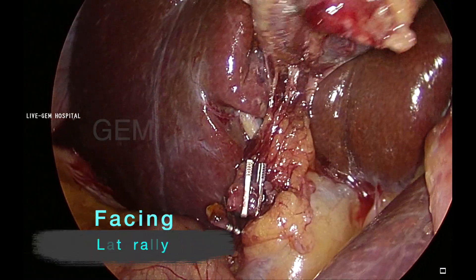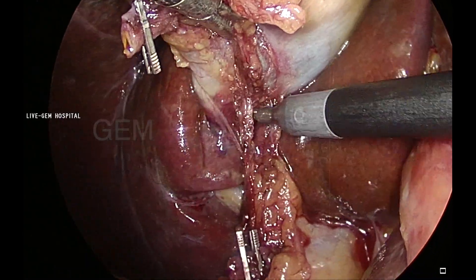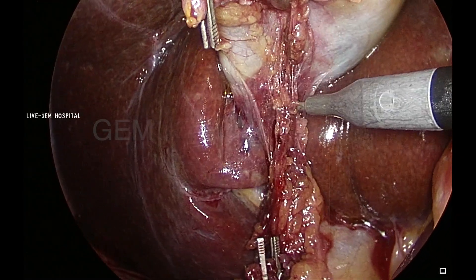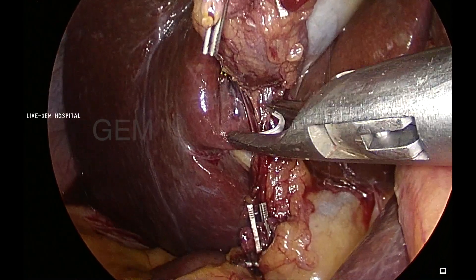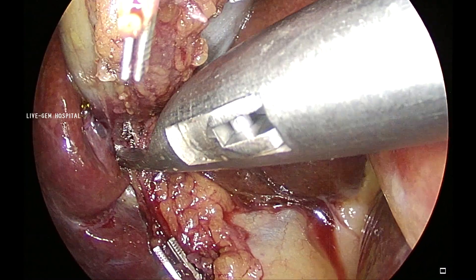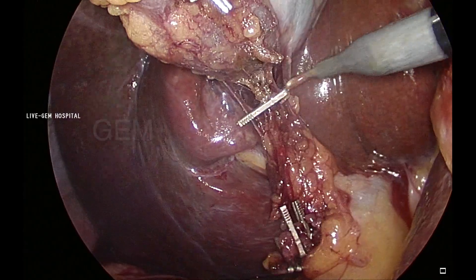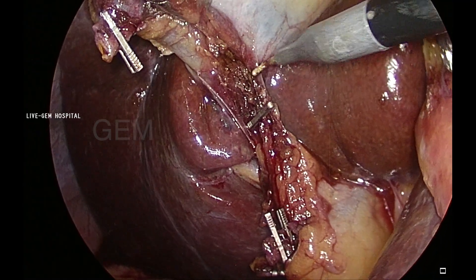Once you leave it, the duct is facing laterally — that is very important, as it means it is the cystic duct. If it were facing up, some major vessel or duct would be injured. It looks like a small posterior cystic artery — any big or small posterior cystic artery you see, you have to apply a clip. In this case I did not use any harmonic or LigaSure, only monopolar. But my practice is, if I see any posterior artery, I clip it. This is the cystic artery posterior branch — because bleeding during laparoscopic cholecystectomy usually happens from the posterior branch. That is why you have to clip and then divide.